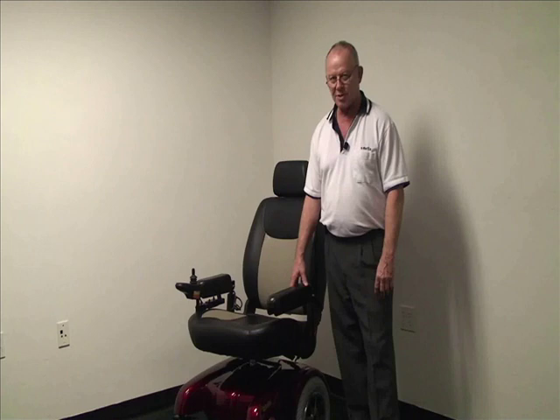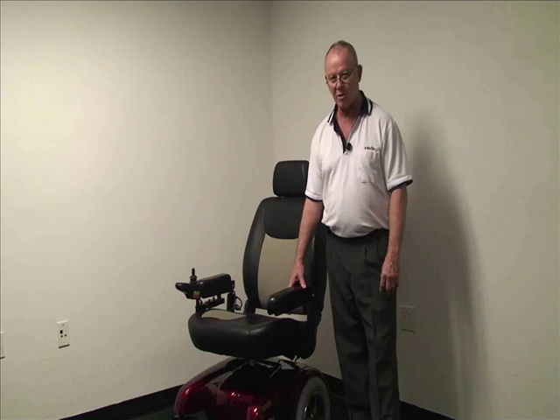Hello, I'm Dwight with Meritz Health Products. Today we're going to talk about our P301 Gemini Power-Based Wheelchair, Medicare Code K0825.